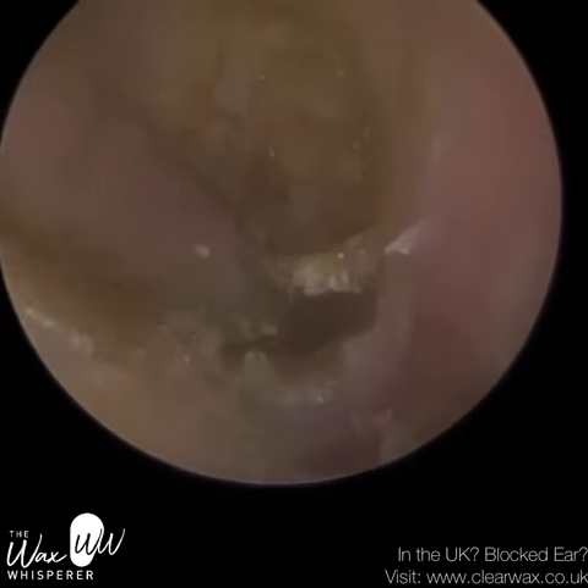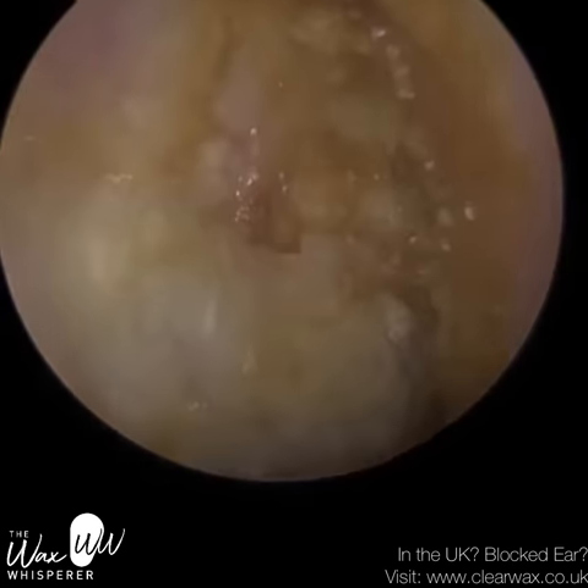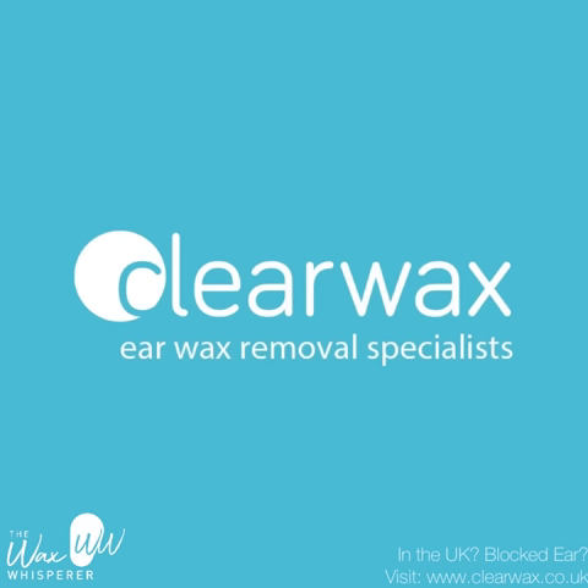You can see the entire eardrum now. Yes, there is some staining — this is really sticky stuff and when we take it away you're going to see a bit of stickiness there. But I'm really happy with that, and I think the patient was also quite exhausted from sitting still for that long. I hope you enjoyed that video — do take care, keep well, speak soon and do stay tuned.